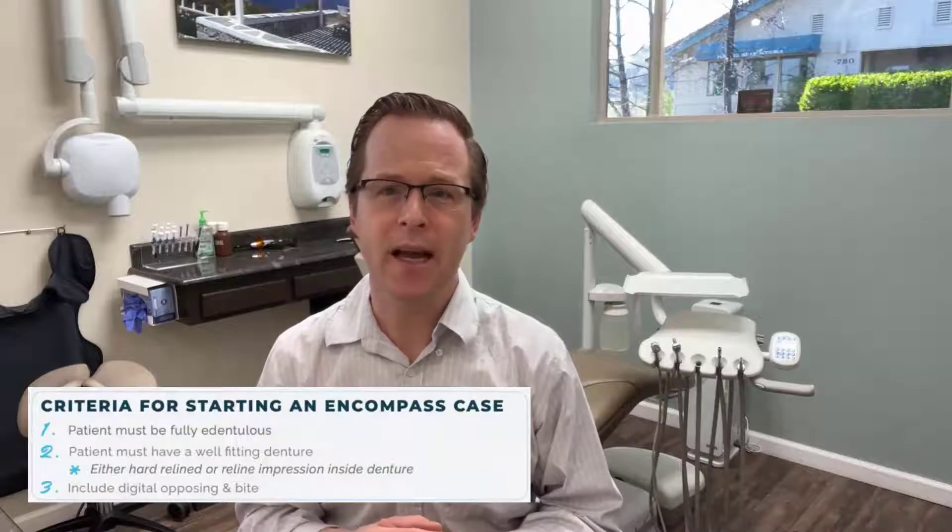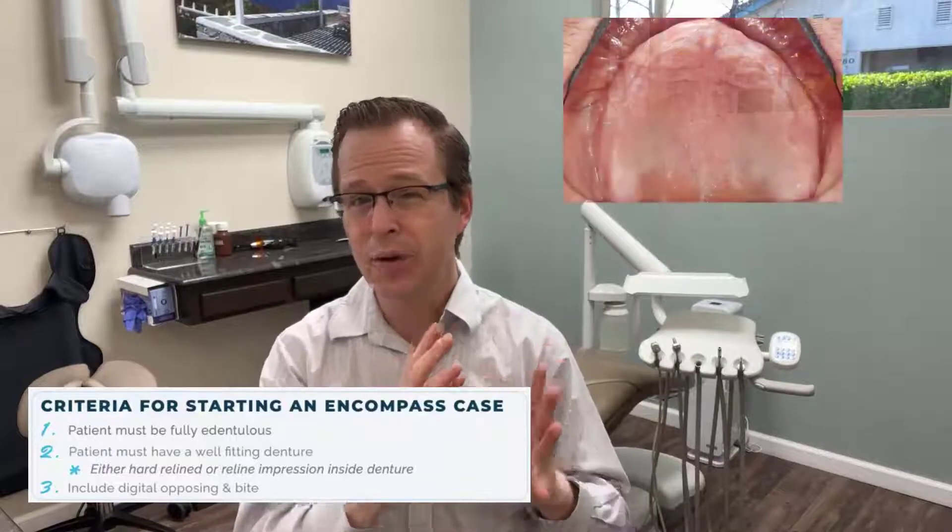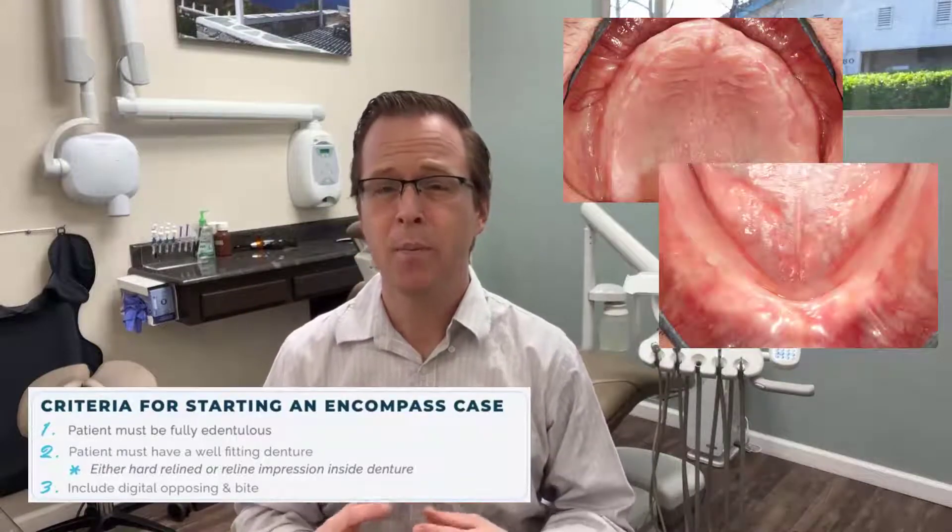In this video, we're going to be talking specifically on the case workup requirements — the information we need to gather prior to sending it off to the laboratory. First and foremost, we have to make sure that we choose our case. Encompass is designed for an edentulous patient working towards either a maxillary or mandibular case. Your patient should ideally already have an existing denture that we can utilize as a reference marker.